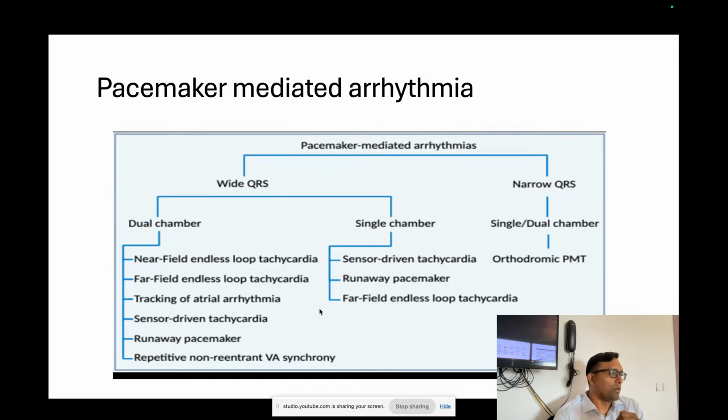And what do you have to do? Disconnect. Transport the patient. If transportation is not possible, just cut the wire and take out the pacemaker. If you have well diagnosed, you are seeing the heart rate is going 200, 300, it is totally a pacing problem. Don't think of it as life saving. If the patient is dependent, you are nothing. The time you cut, he will go into arrest. So ideally, it should be brought to the hospital, put a temporary pacemaker and cut down the wire.